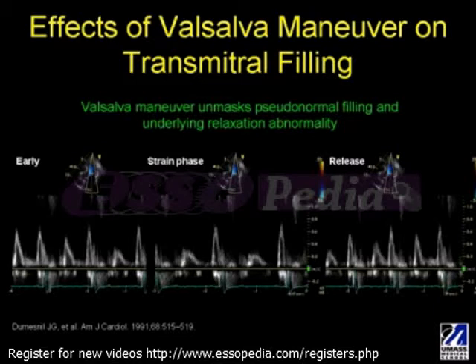Also, it's important to note that the Valsalva maneuver cannot be applied in critically ill patients who are intubated, of which I think estimation of filling pressures could be extremely helpful in these patients.